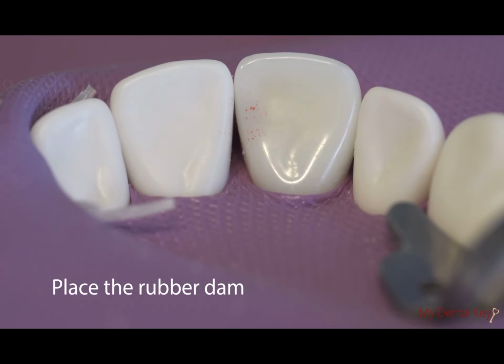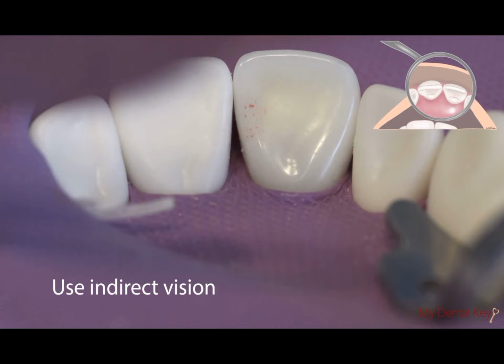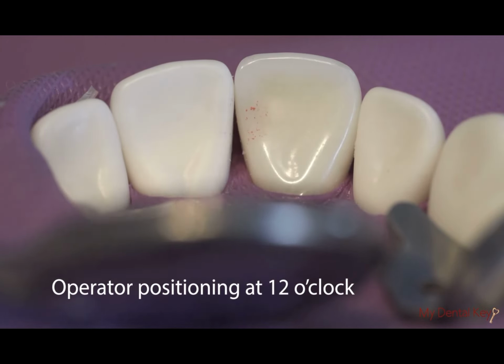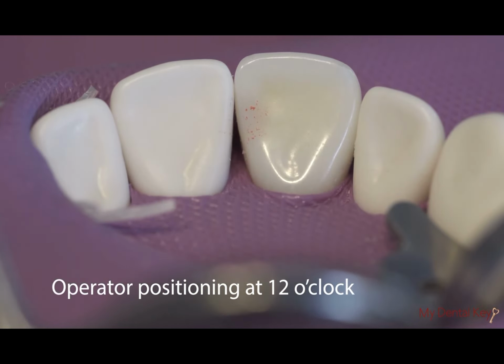Obtain proper isolation of the tooth using a rubber dam. In this procedure, we will be using indirect vision to visualize the cavity preparation. To best use indirect vision, it is suggested that the operator sits at the 12 o'clock position in relation to the patient.